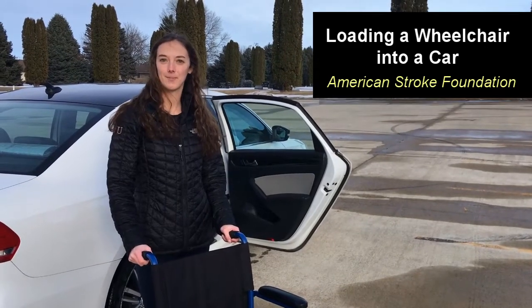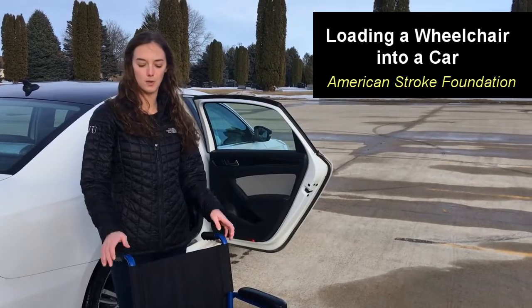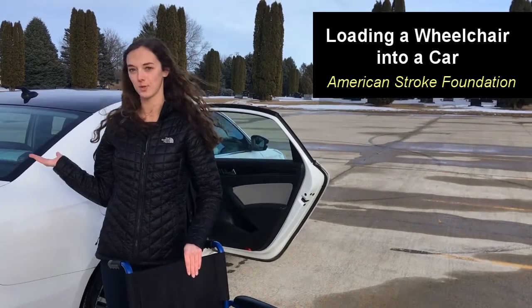Hello, my name is Carrie Campoff and I'm an Occupational Therapy student. Today I'll be teaching you how to properly load a wheelchair into a car.